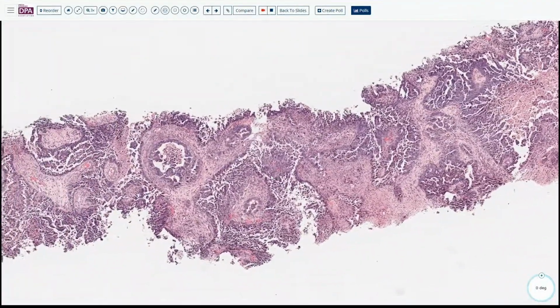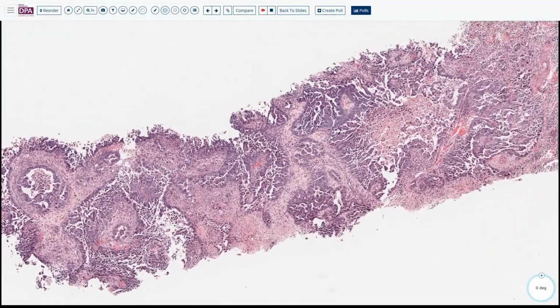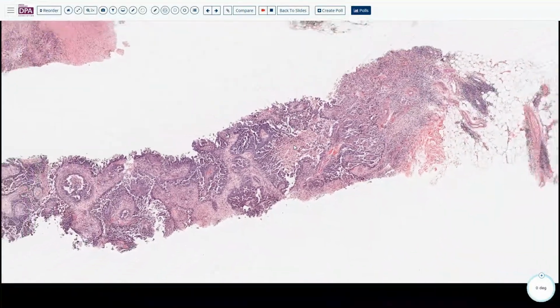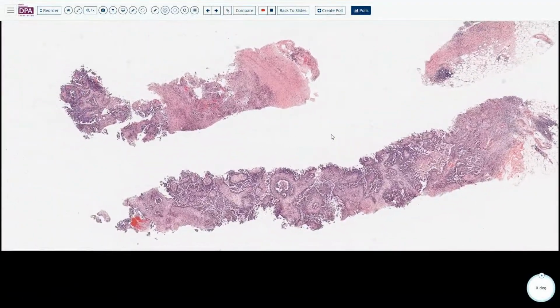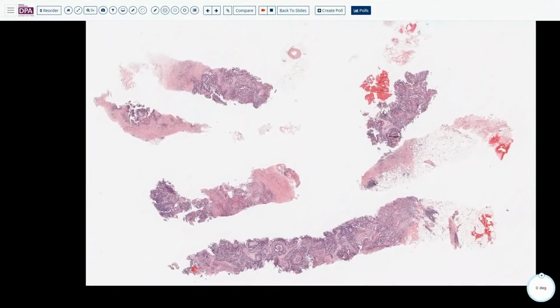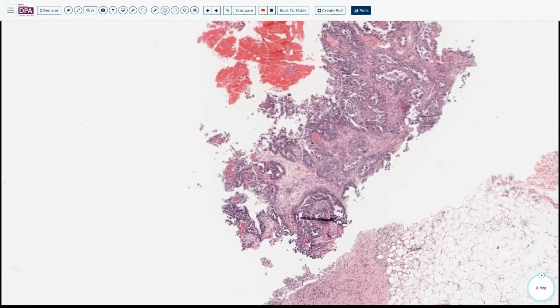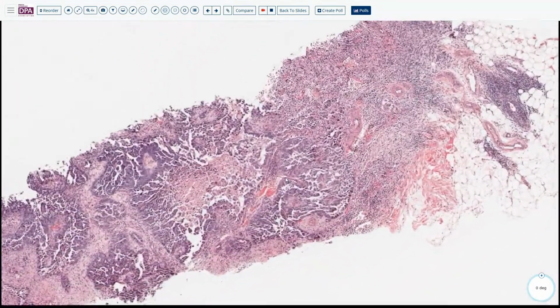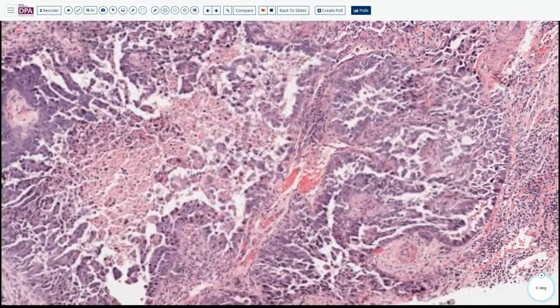So then you will do a bunch of staining. For this one, you can have PAX8 positive, WT1 positive, and other breast markers like TRPS1 and GATA3 negative. So if the provider gives you the clinical history of high-grade serous, it's really easy. But based on these markers, you can also go back and tell the provider it is probably not from the breast. This is a high-grade serous carcinoma metastatic to the breast.